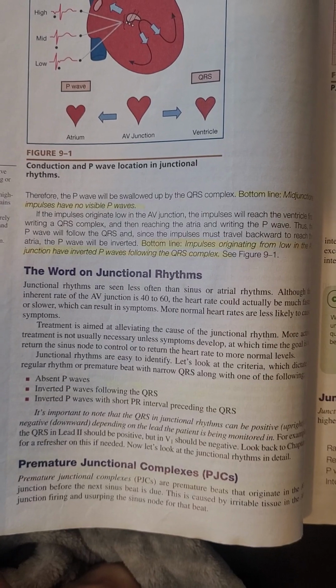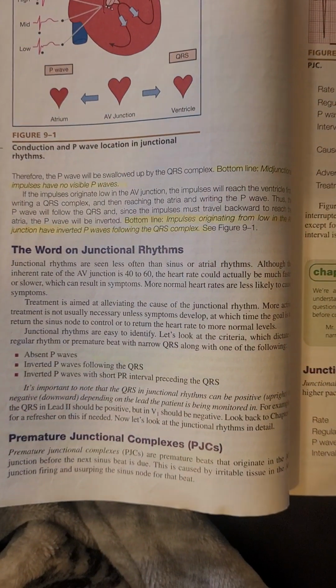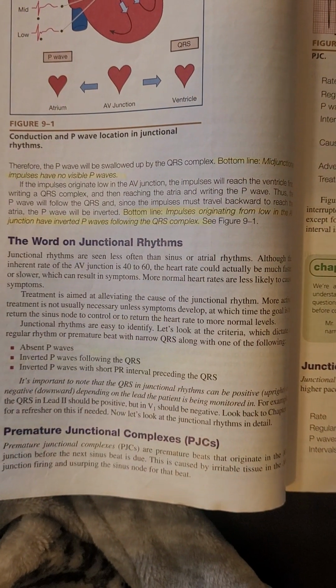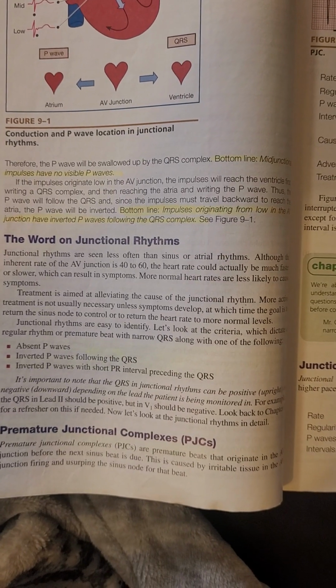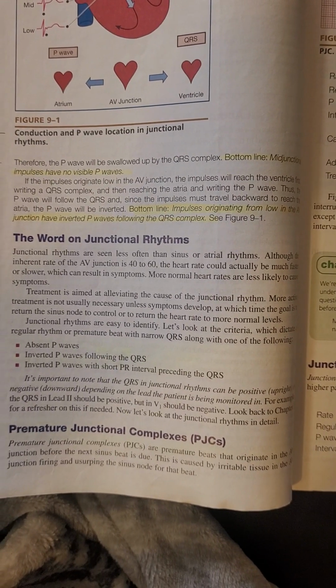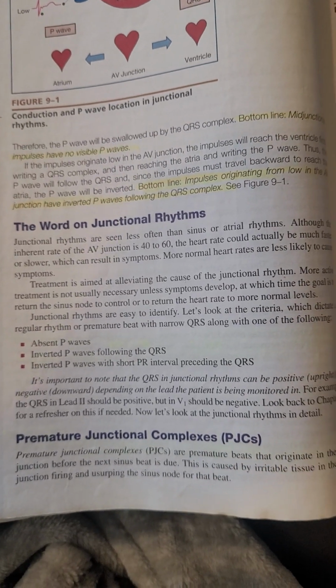That's why I say, although the inherent rate of the AV junction is 40 to 60 beats per minute, the heart rate could actually be much faster or slower, which can result in symptoms. More normal heart rates are less likely to cause symptoms. So again, junctional rhythms are easy to identify.